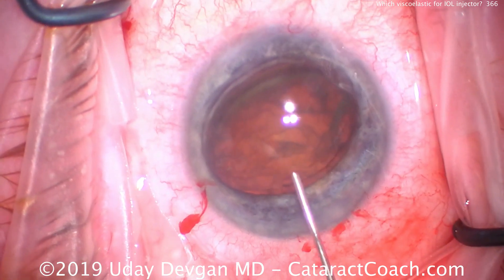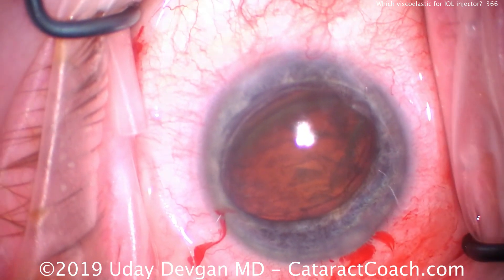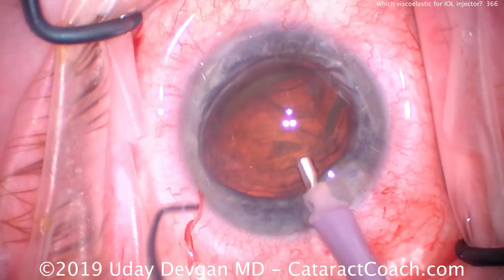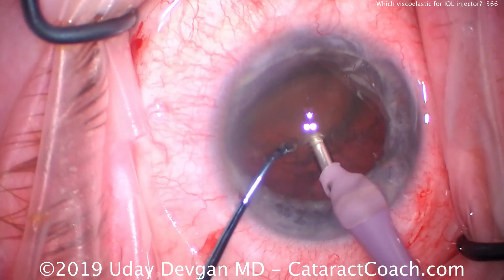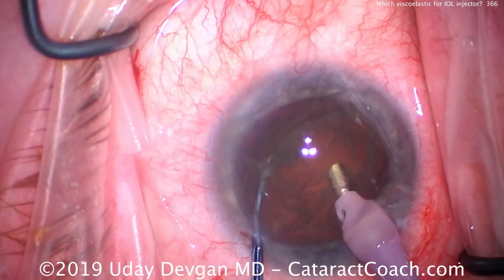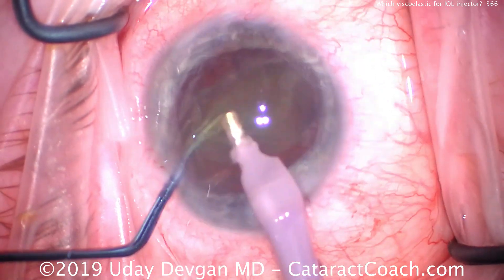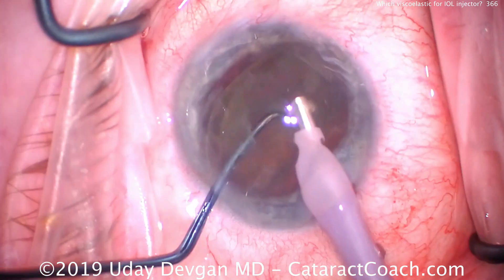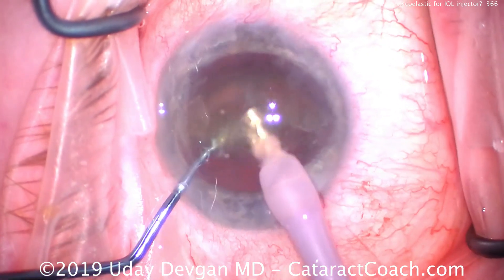During phaco we can perform all these maneuvers — here I'm bringing the nucleus out of the capsule bag, we'll chop it, using high flow at 40 cc's per minute — and yet we still have that dispersive agent protecting the corneal endothelium. If we use a cohesive agent, it's easily washed out of the eye.